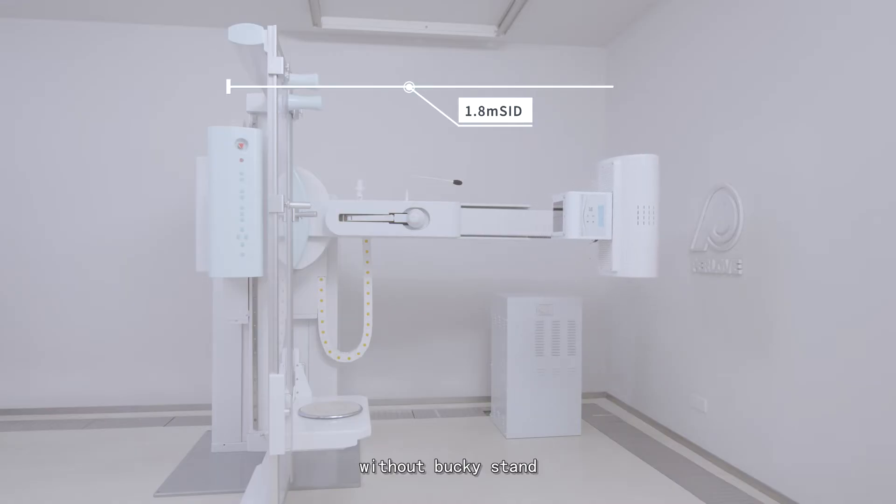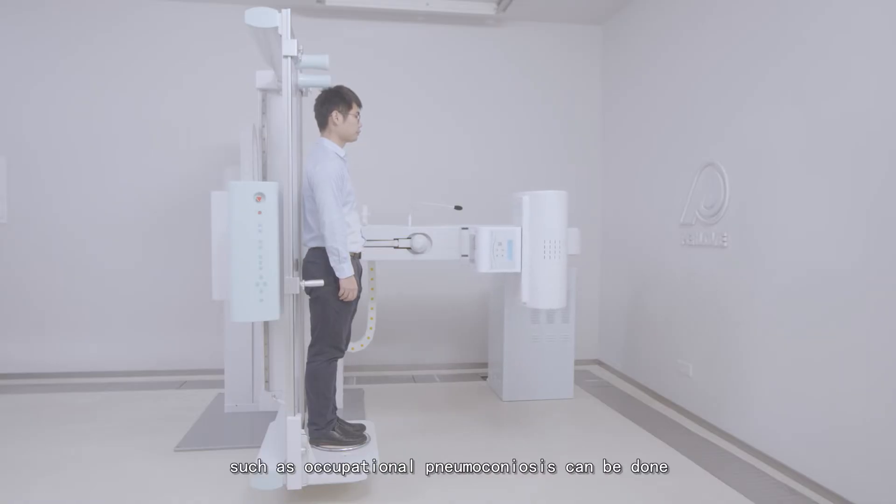Without a bucky stand, accompanied by high-kilovolt radiography, special chest examinations such as occupational pneumoconiosis can be performed.